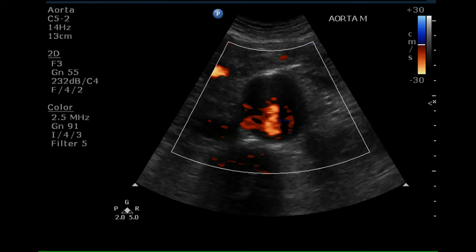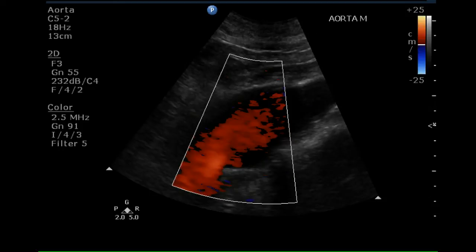Color Doppler of a transverse projection of this aneurysm demonstrates an area that does not fill with moving blood and is likely thrombus. Sagittal image of the aneurysm demonstrates a rind of thrombus surrounding the aneurysmal dilatation.